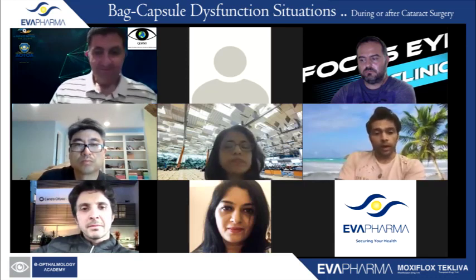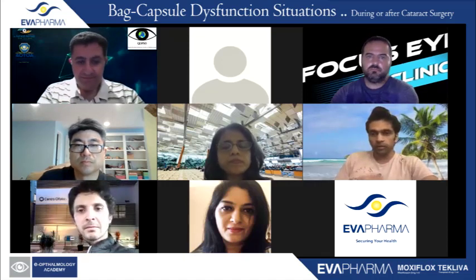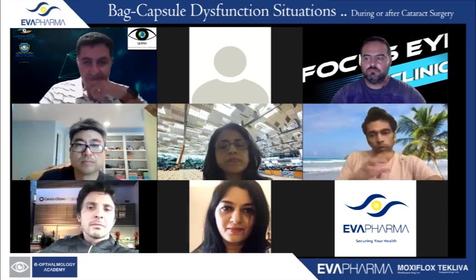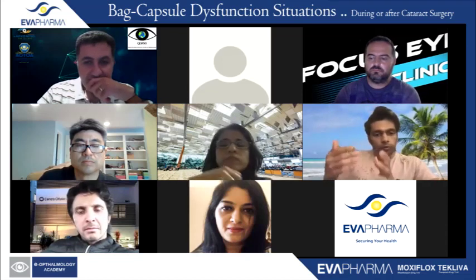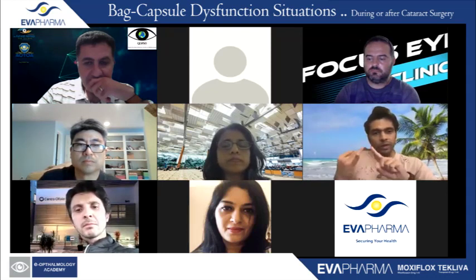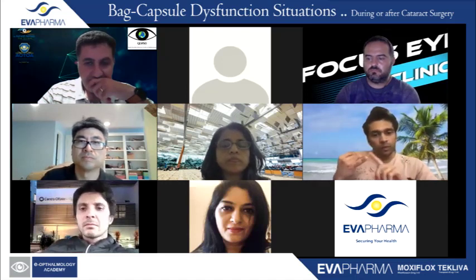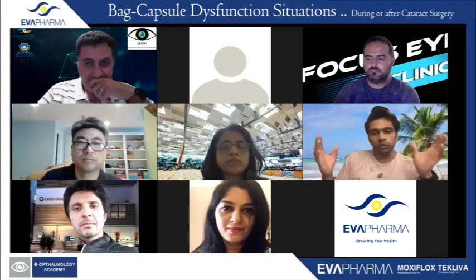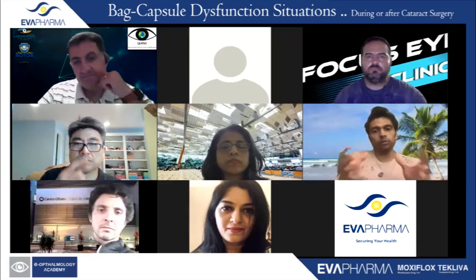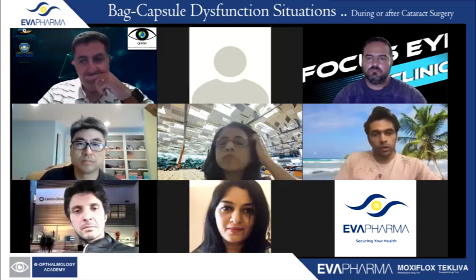Ashvin, any other questions from the panel? I wanted to know, you guys have also done glued IOL at some point. Do you see yourself probably using this technique? I know that most of the apprehension that even the viewers would have about doing the glued technique is probably vitrectomy, probably making flaps, and so on. But vitrectomy being the one which anterior segment surgeons don't want to do, does this procedure actually help you move to glued intraocular lens in some way? Maybe not all indications, but at least some indications are definitely here.